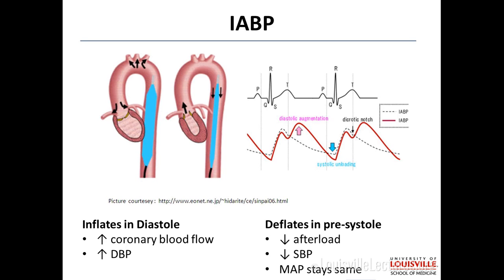These can be put in at the bedside. It can be put in blind. And an important note, if you ever have a patient with a balloon pump, what do they need every morning?